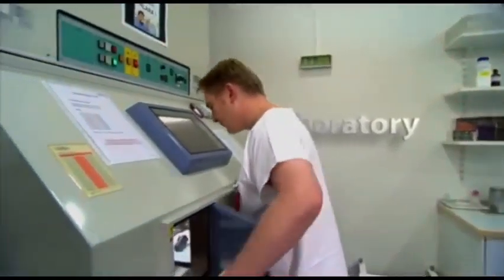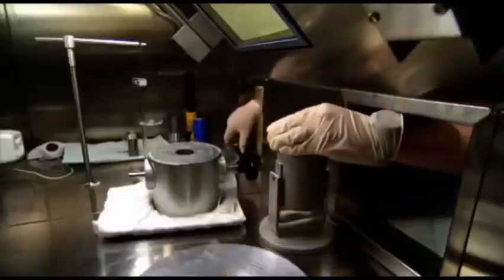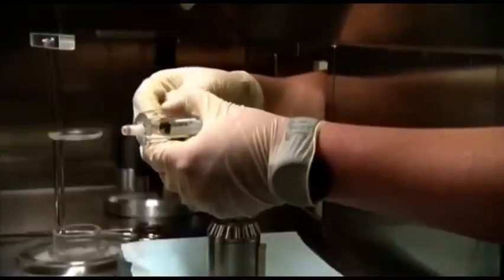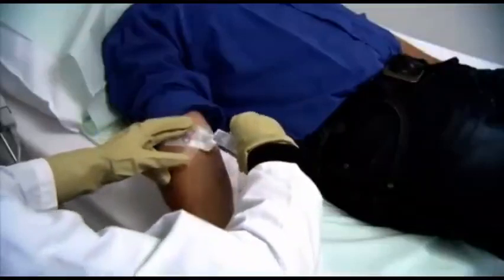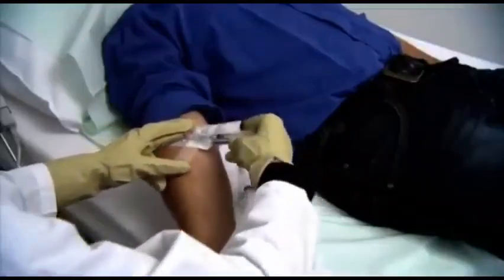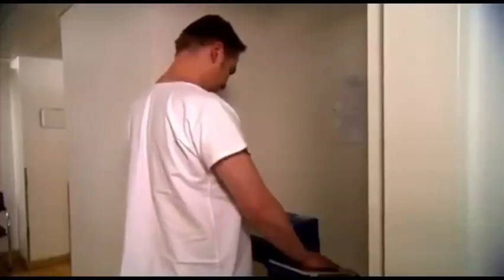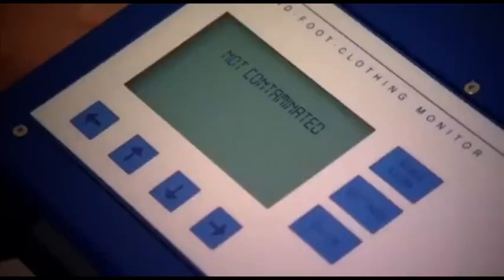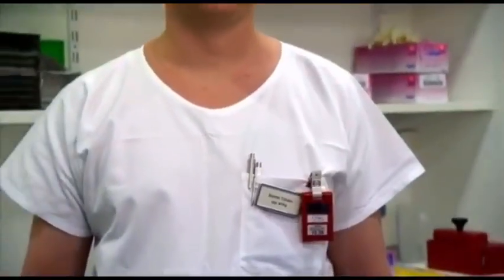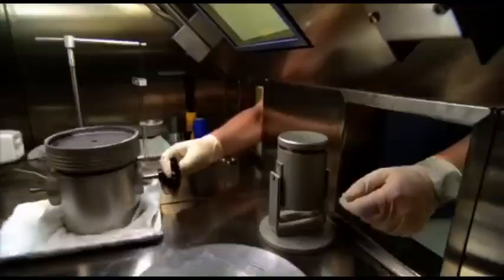The nuclear medicine facility should be well planned with a sufficient number of rooms for intended operations, including the storage and disposal of radioactive waste, as approved by the competent authority. All the equipment required for safe handling should be available in each room for the proposed operation. The staff should be adequate and well trained in handling radioactive material. Radiation monitoring instruments such as survey meters, contamination monitors, pocket dosimeters, digital monitors, etc. and a decontamination facility should be readily available.